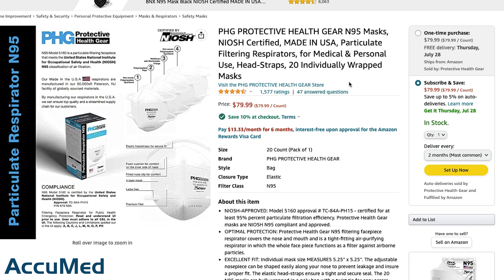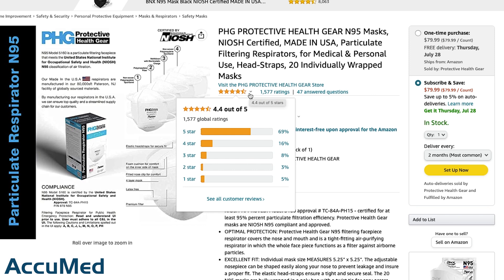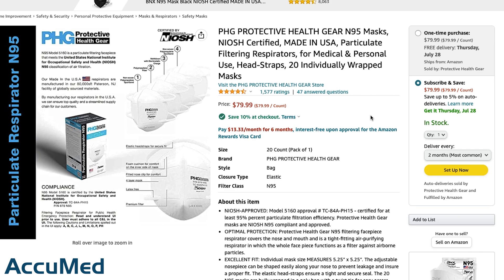These respirators come in a box of 20 individually wrapped masks for $79.99. This listing has a 4.4 out of 5 rating with 1,577 reviews.